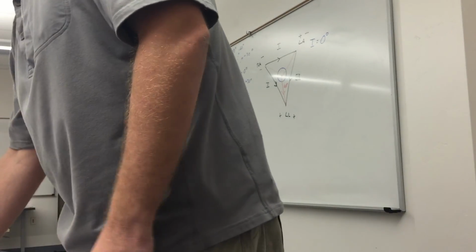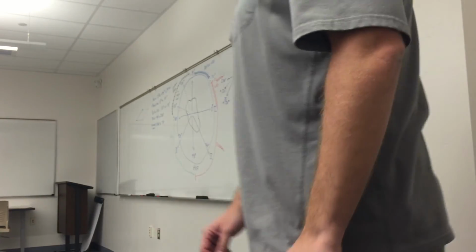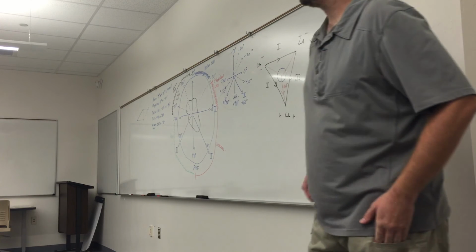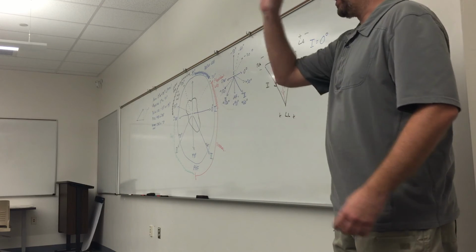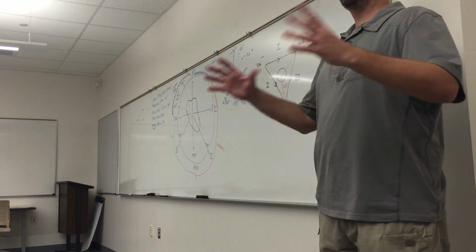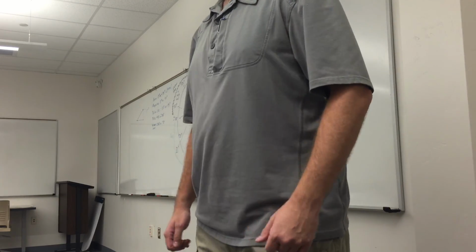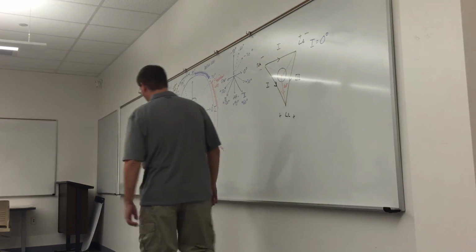Never mind, missing all the writing on top of the degrees. Yeah, I know. Sorry about that. But we will get to the point where we're looking at the writing on top. Oh, it was upside down. How about that? Everyone got one? Everyone good? Got it? Cool. All right. So let's determine the axis of that 12 lead that I gave you guys.